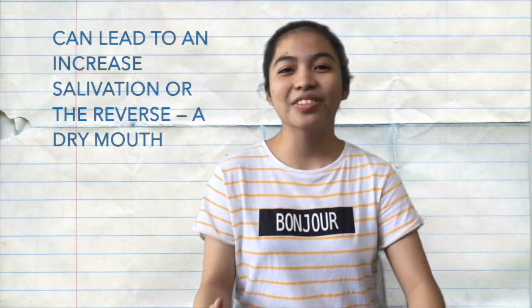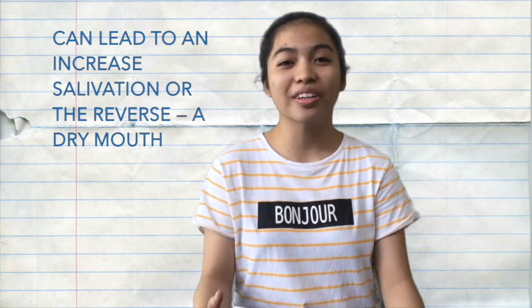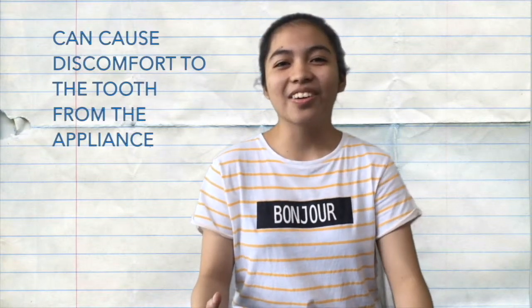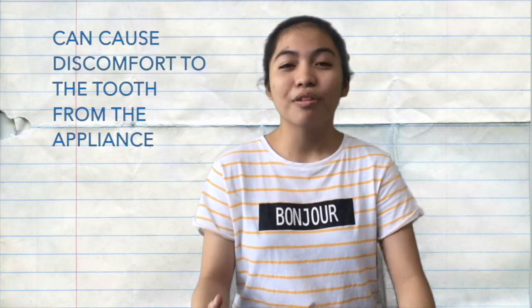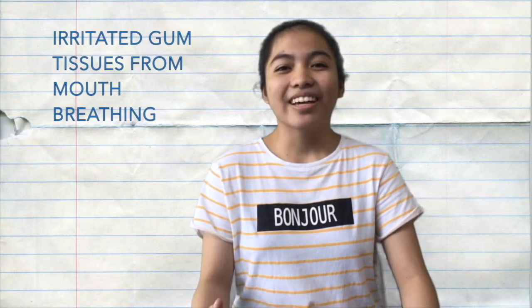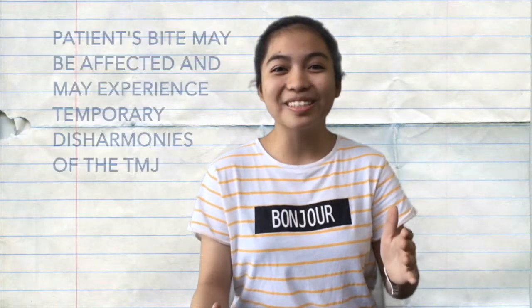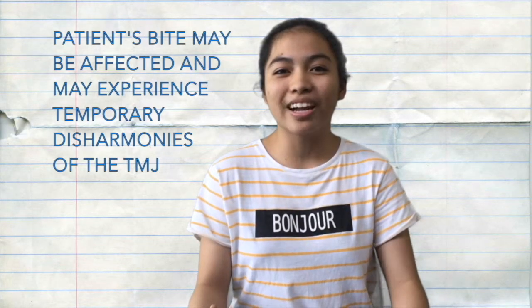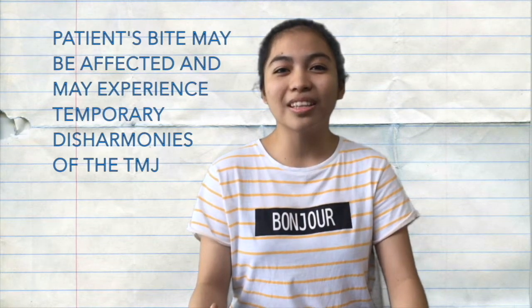First, it can lead to increased salivation, or the reverse, a dry mouth. Second, it can cause discomfort to the teeth from the appliance. Third, irritated gum tissues from mouth breathing. And oh no, the patient's bite may be affected, and they can also experience temporary disharmonies of the temporomandibular joint.